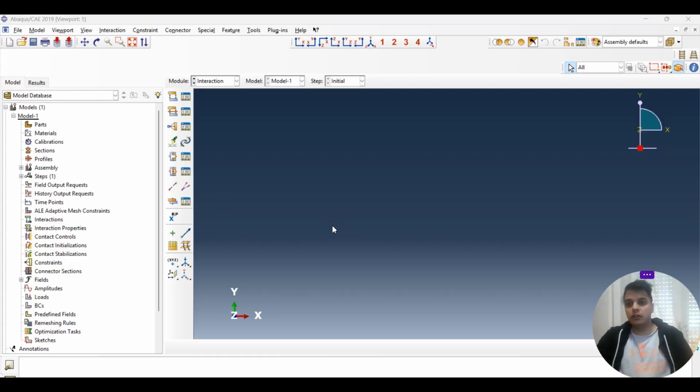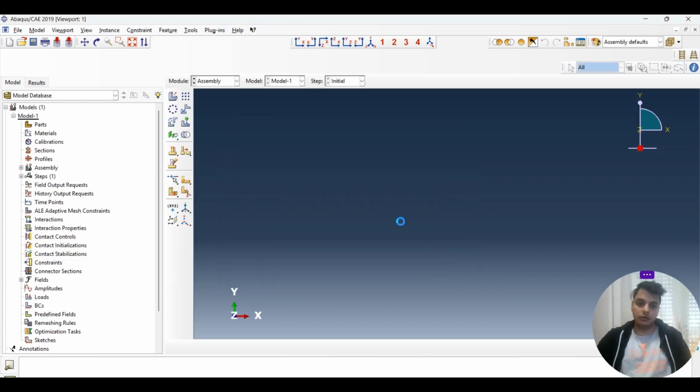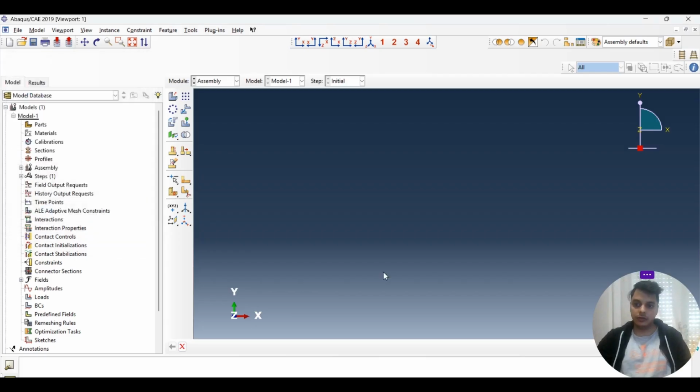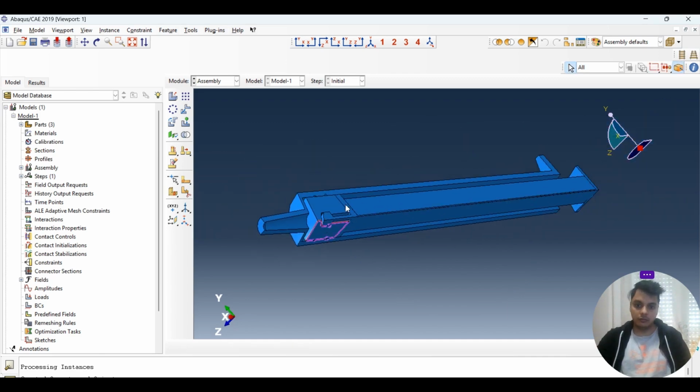So what we have to do is import our geometry. I have already taken a part of it, so we simply go to import assembly, and this is the part that I'm looking for. It asks for all the components, so I say yes. So right now we have a syringe, a quadrant of it. Why we need a quadrant is because we have to reduce the computational power.